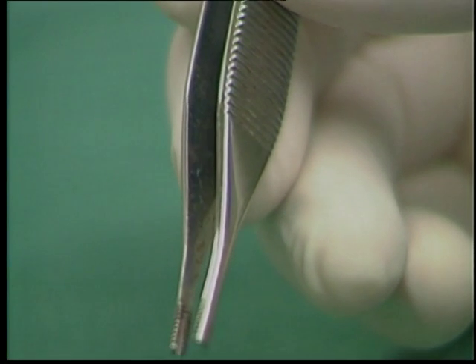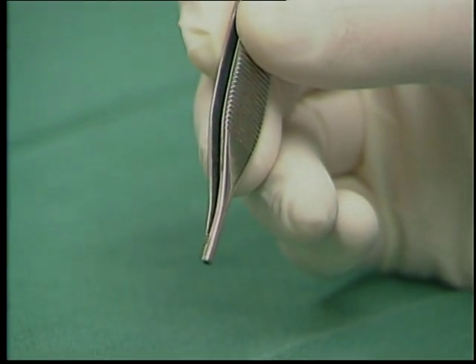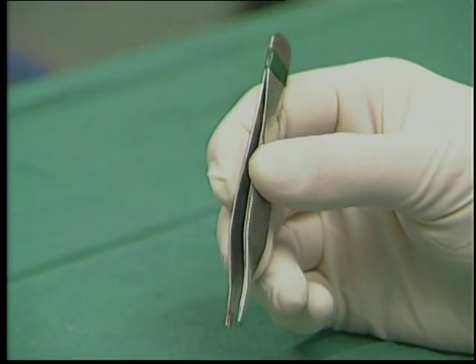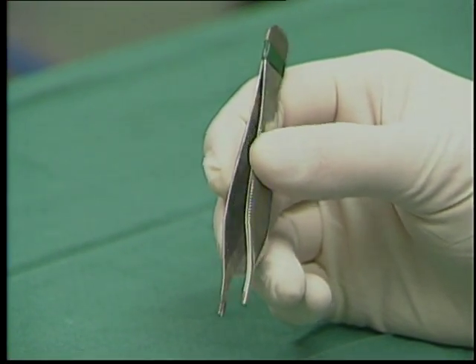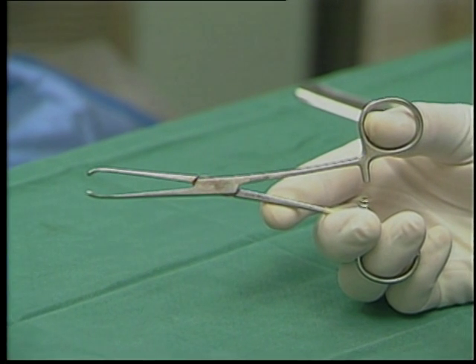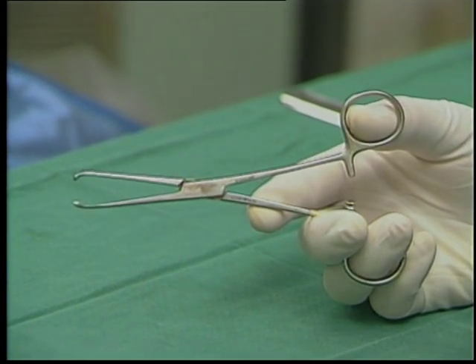Forceps are generally instruments used to grasp and hold tissue. The thumb tissue forceps are simple to use with their spring action design. These Brown Adson forceps are equipped with additional teeth that allow them to stabilize the tissue without having to crush it. Another type of forceps are tissue forceps. The most common type of tissue forceps is probably the Allis tissue forceps. This instrument will hold tissue with a locked grip with moderate trauma to the tissue.